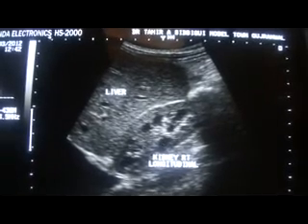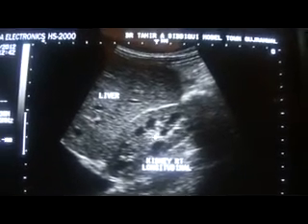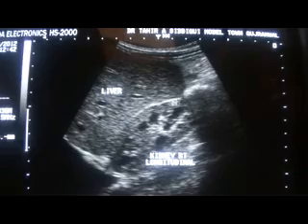Note another third thing: the central sinus echo complex, which should have been seen here in the encircled area — there is no central sinus echo complex, so the central sinus echo complex is lost.